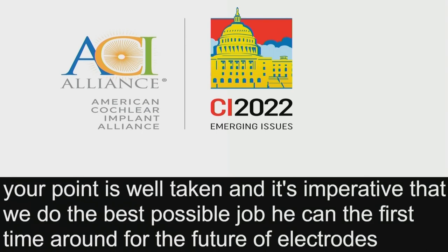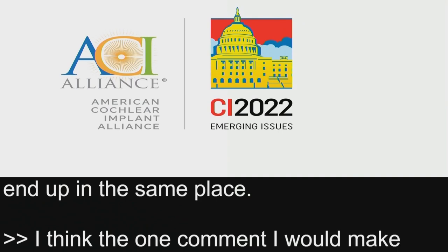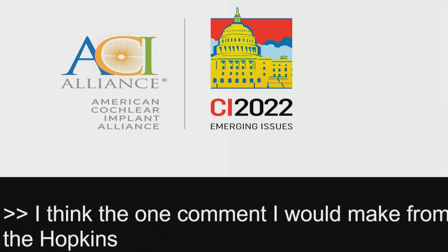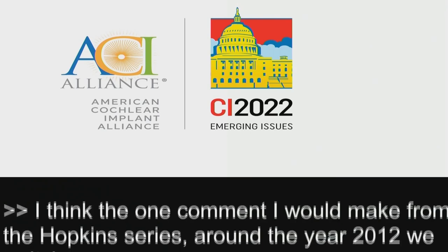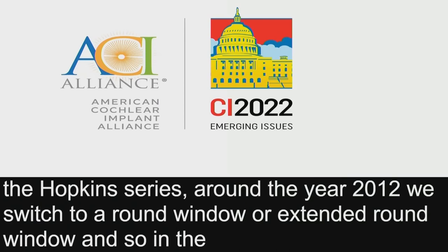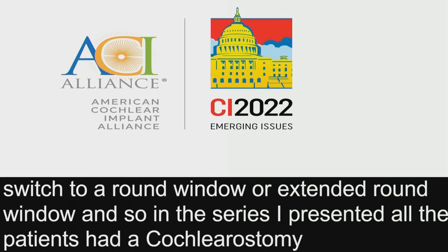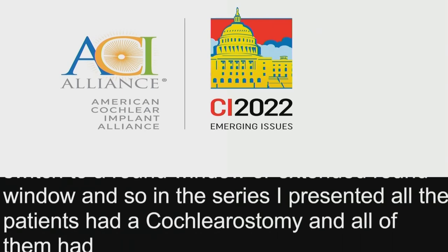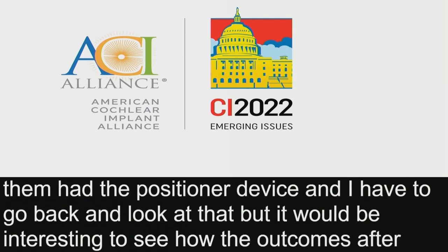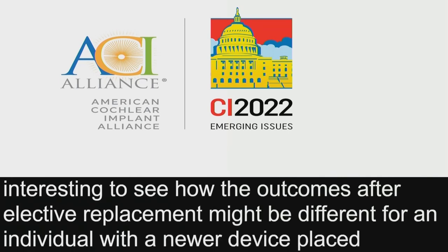I think the one comment I would make from the Hopkins case series is, at our institution, around the year 2012, we switched from a cochleostomy insertion to a round window or extended round window. And so in the case series that I presented, all of those patients had a cochleostomy, and I think all of them had the positioner device. So I would have to go back and look at that. But it'd be interesting to see how outcomes after an elective replacement might be different for an individual with a newer device that was placed via extended round window. Because you could imagine it's being placed differently in the cochlea, so I don't know.